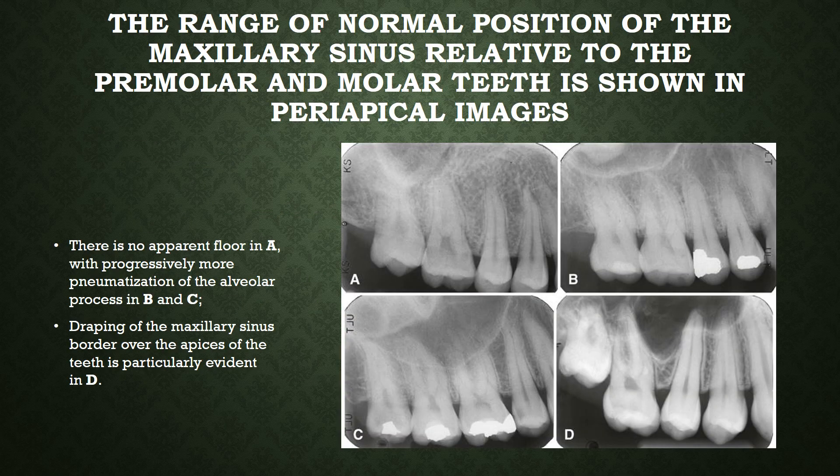The range of normal position of the maxillary sinus relative to the premolar and molar teeth is shown in these periapical images A to D. In image A, there is no apparent floor of the maxillary sinus. In images B and C, there is progressively more pneumatization of the alveolar process. In image D, there is draping of the maxillary sinus border over the apices of the teeth, which is very particularly evident.